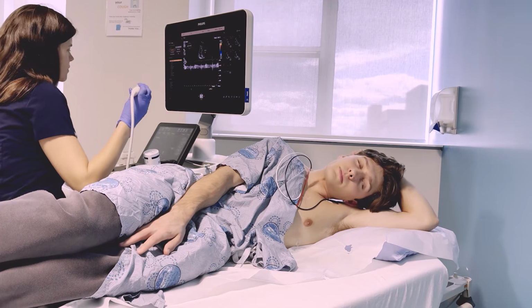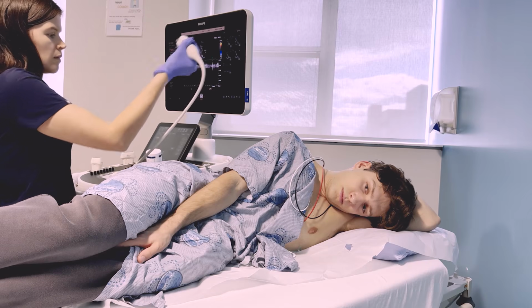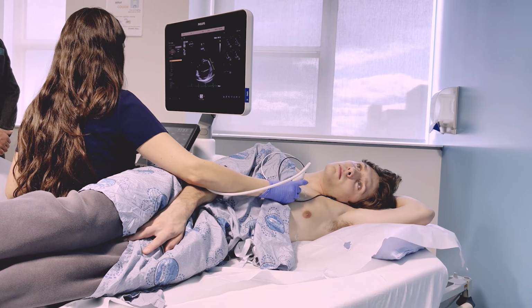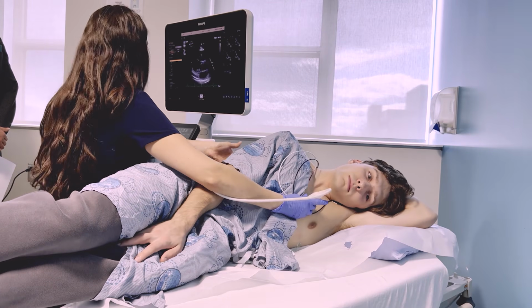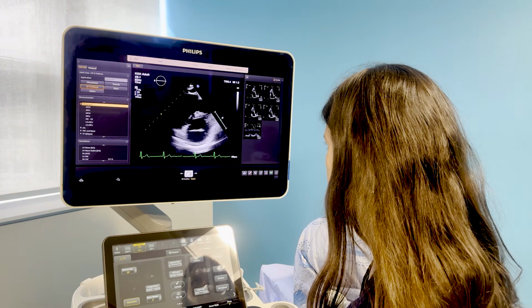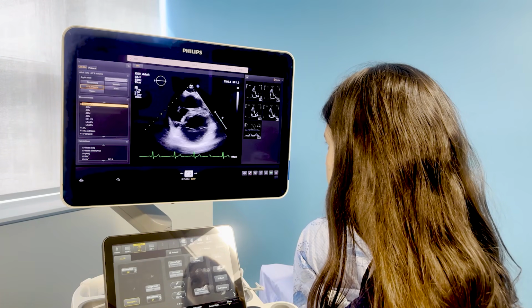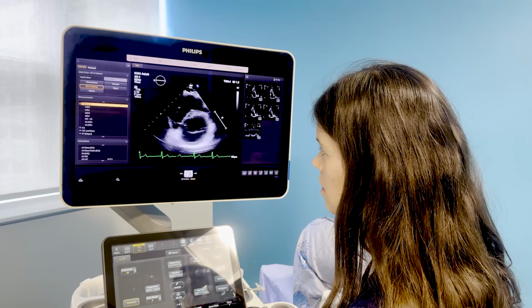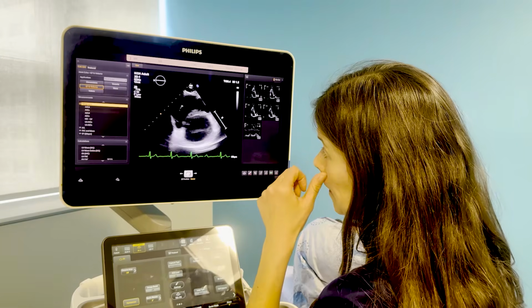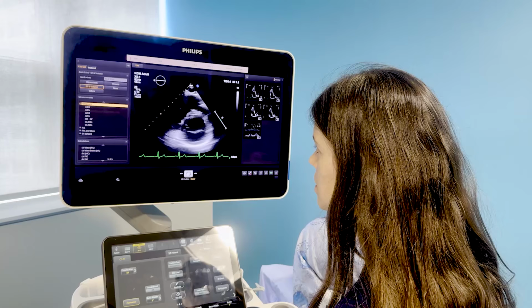So the guidelines are suggesting measuring that in the short axis view. They're still leaning forward just a little bit here. So tell us about how you're optimizing this view. Well, I'm trying to have a nice round-looking LV short axis here, because looking at the septum will tell you a lot about what different pressures are between the RV and the LV. His septum is nice and round in systole and diastole.